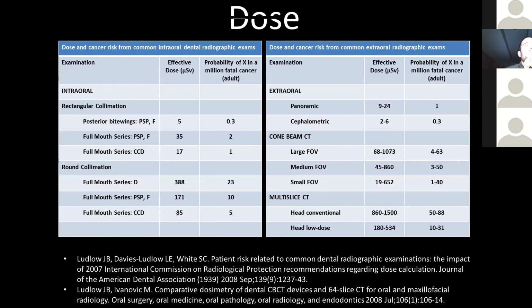That'd be for a simple patient. For a patient with complex dental presentation, or you're just seeing a lot of clinical disease, a full mouth series, that's the route the ADA takes right now. For the most part, cone beam CT at this time is thought to be too much dose with not enough diagnostic yield. 20 years or even 10 years from now, we might look back at and be imaging in 3D as doses go down. But the recommendation from the ADA is what it is right now.